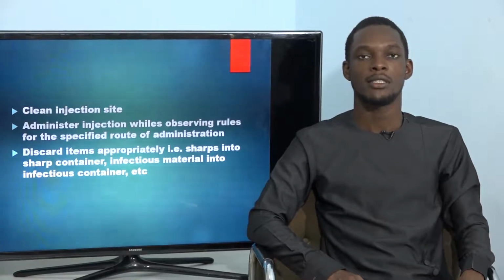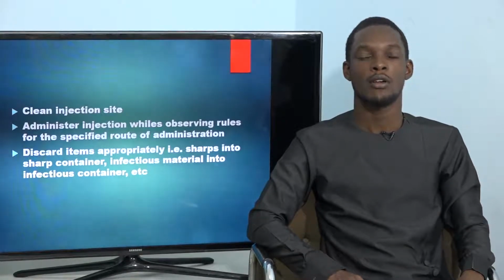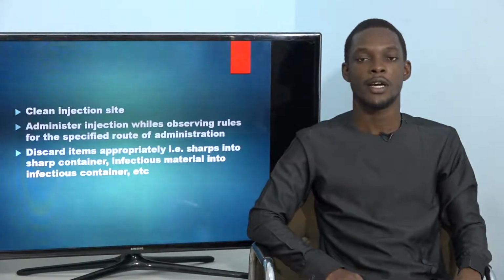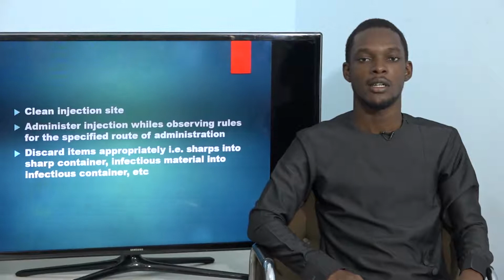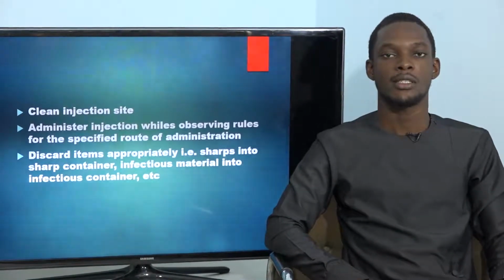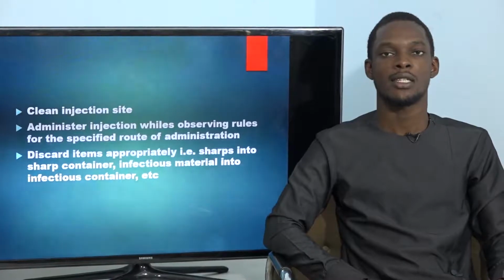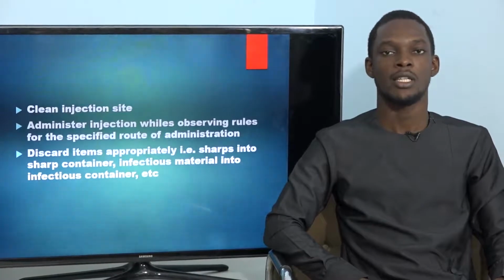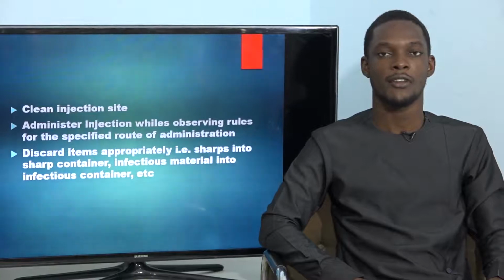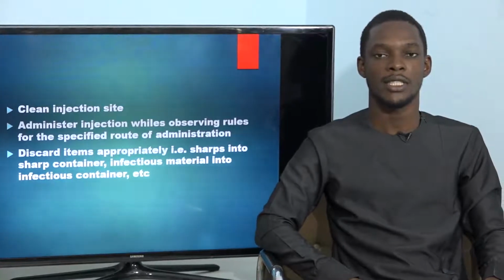Administer medications whilst observing all patient rights for drug administration. After the injection has been administered, ensure that all materials are discarded appropriately to prevent cross-infection or injury during the administration or after administration of medication.